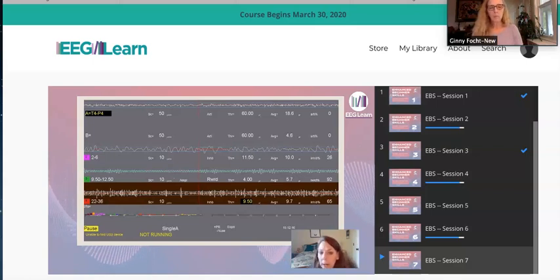So I set my hurdle somewhat easy, because I want to make sure a beep is readily available as long as they're figuring out how to bring their fast frequency beta down. Later on, as they get better at bringing their fast frequency beta down, I might change the focus of my training to getting that alpha amplitude to come up.